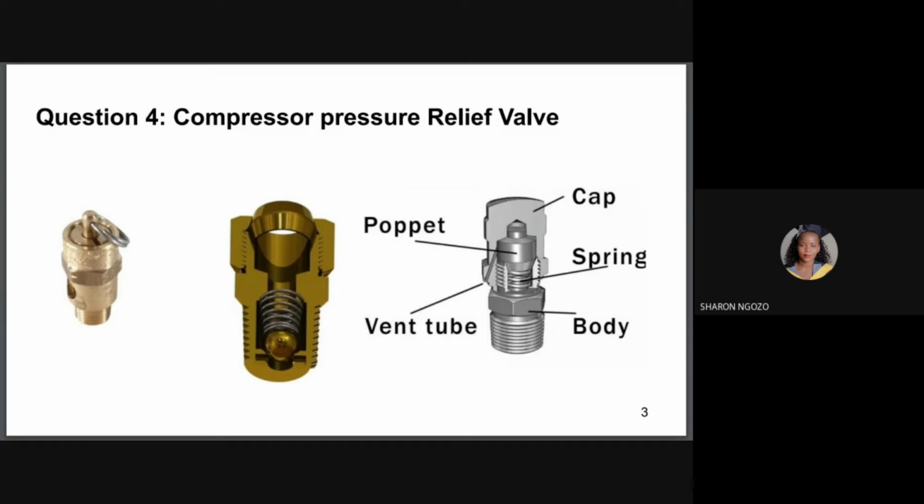Secondly, your solenoid valve or rotary valve might be faulty. So you have to check if the valves are getting their rated voltage from the board. You need a multimeter for this. If they are receiving voltage from the board, you need to check continuity of the wire harness of the valves.